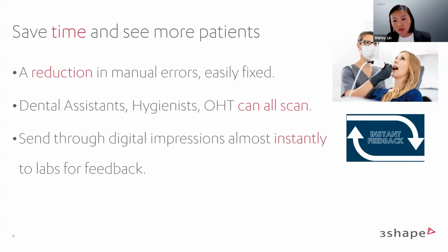They can give you that feedback. They can calculate if it is good enough as an impression, and then let you know while the patient's still there at the practice.